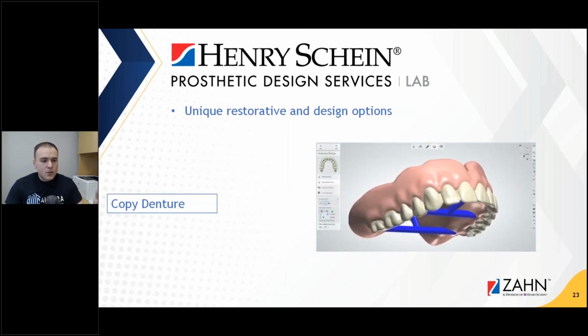The next one I wanted to touch on real quickly is the copy denture. What we've seen really is this huge influx of patients who have worn dentures for a long time. And so the denture breaks, needs to be relined, and so on. The material is falling apart, the acrylic's no good, but they really like how the denture looks.